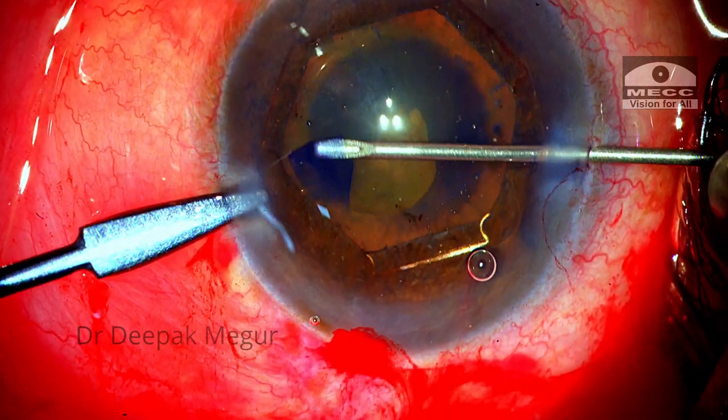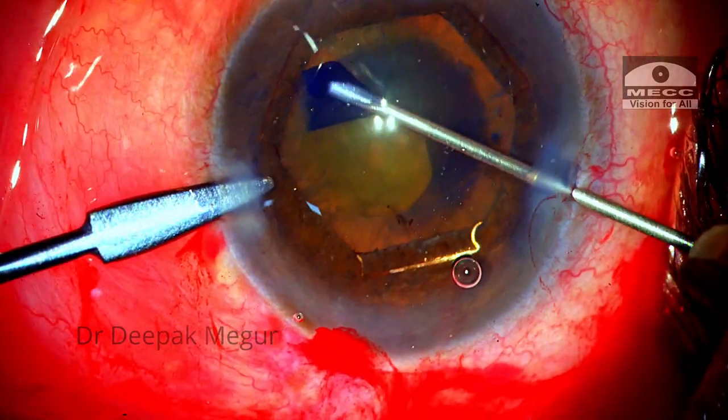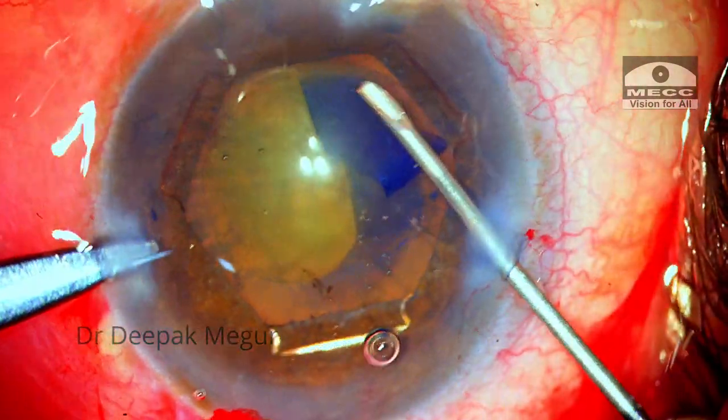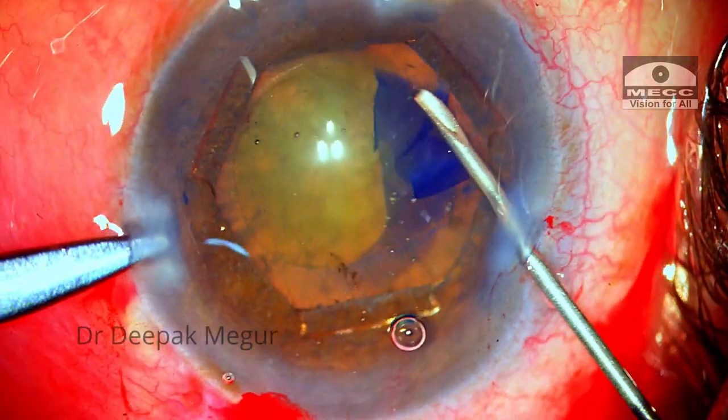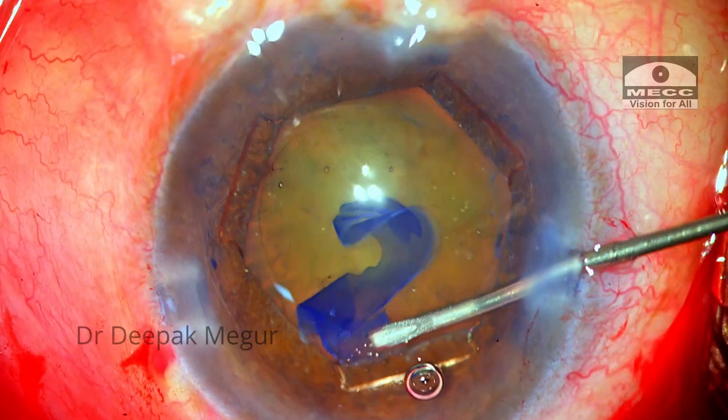The rhexis is initiated with the needle and as I am tearing, I can feel that the zonules are weak. But at this point they don't seem alarmingly weak, so I could manage with the needle itself rather than switching back to forceps.